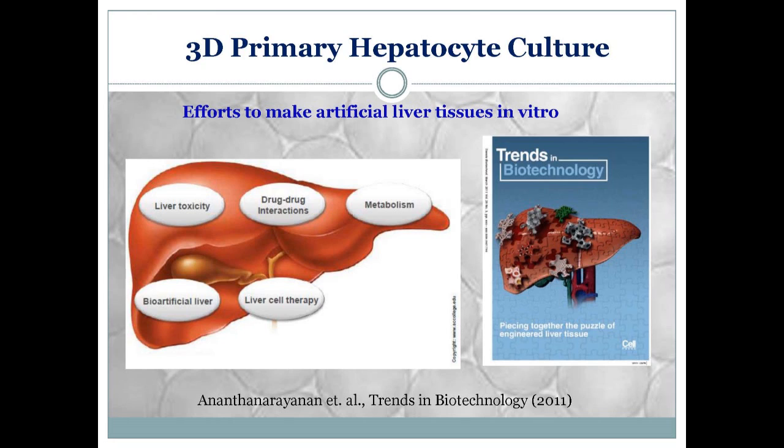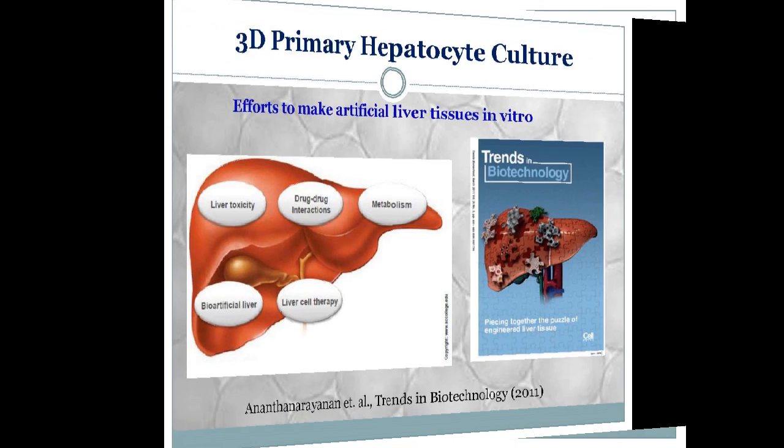3D systems allow for enhanced preservation of complex in vivo cell phenotypes due to the compactness of cells compared to conventional 2D cultures. Furthermore, tight cell-to-cell junctions in 3D systems help maintain cell viability and high-level liver-specific functions, such as cytochrome P450 activity, albumin secretion, and urea synthesis.